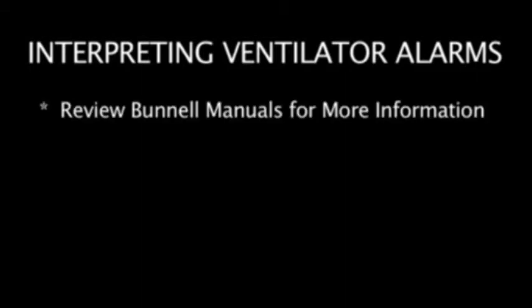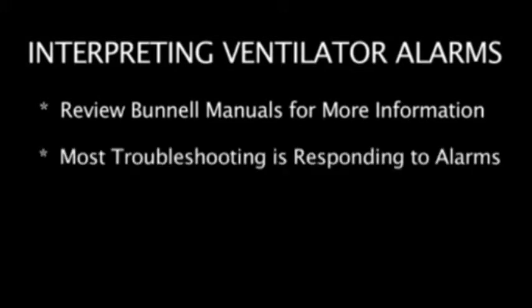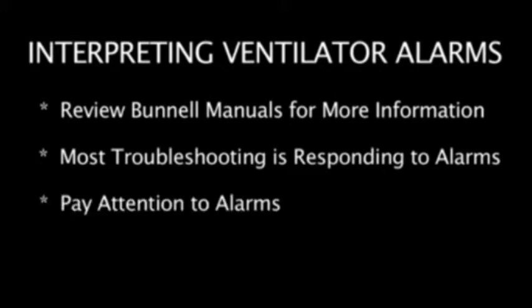Many ventilator problems and corrective actions we've already covered, and a more comprehensive review is offered in the operator's and service manuals. But there are a few general principles that can simplify LifePulse troubleshooting. Most of the necessary troubleshooting will be in response to alarms. It is recommended that when a patient is on the LifePulse, you first pay particular attention to the ventilator alarms.